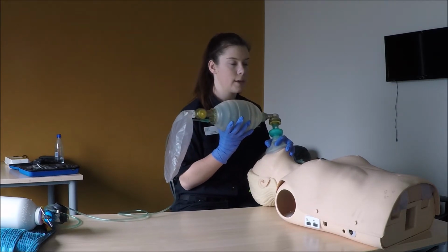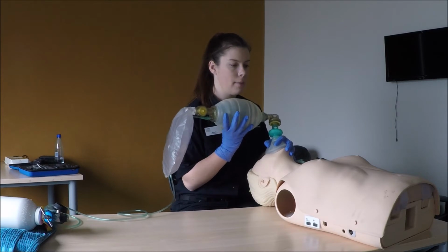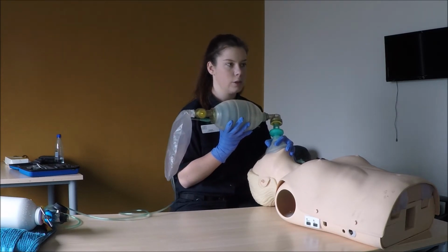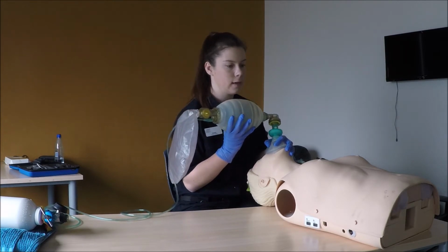We're also checking for gastric inflation, and if it was necessary, we could get a second person or an offsider to apply cricoid pressure if we needed it.